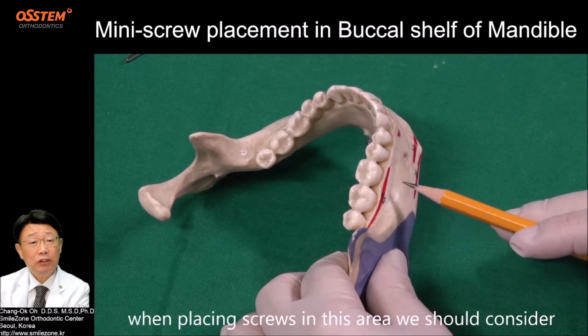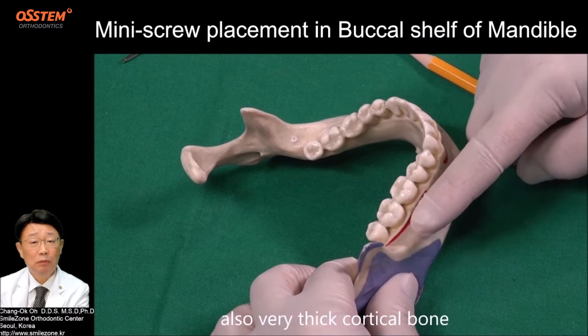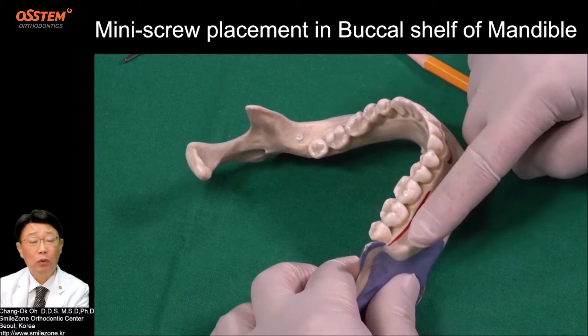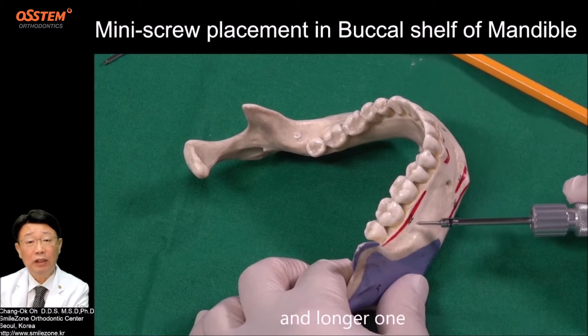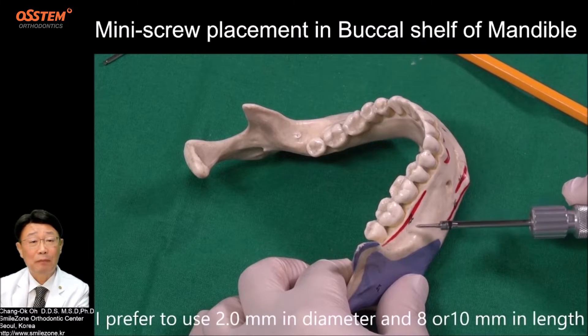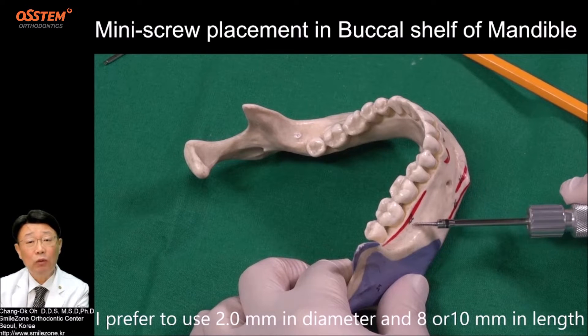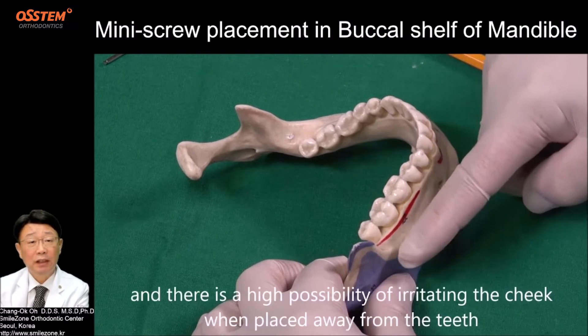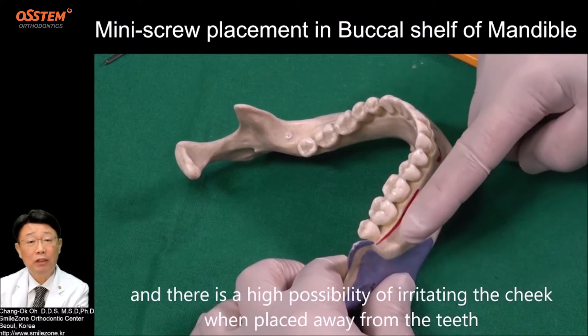When placing screws in this area, we should consider very thick and movable mucosa, and also very thick cortical bone. So we should choose a thick screw in diameter and a longer one. I prefer to use 2.0 mm in diameter and 8 or 10 mm in length. There is a high possibility of irritating the cheek when the screw is placed away from the teeth.